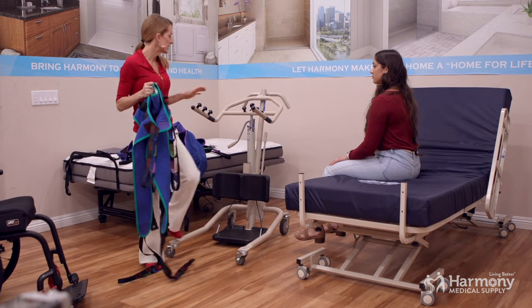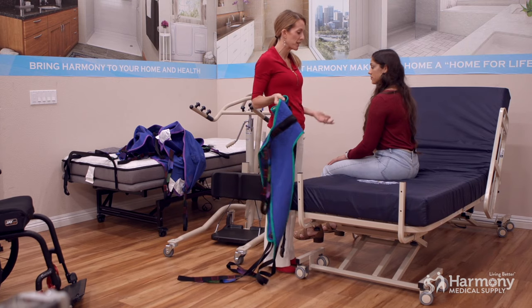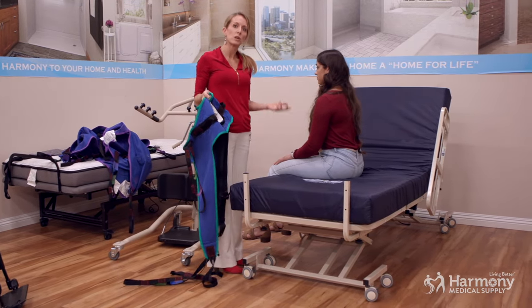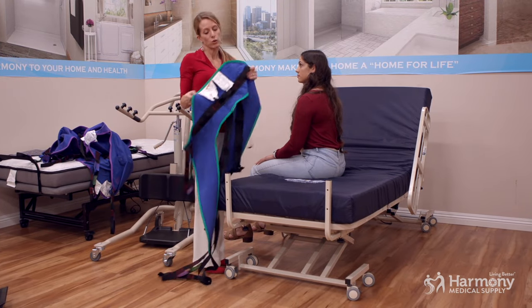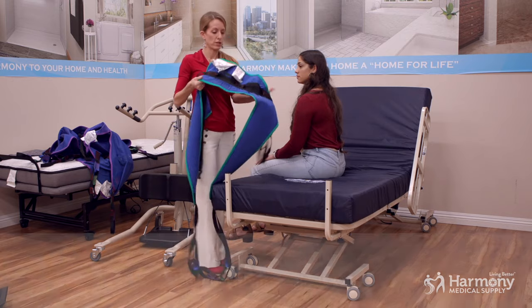With the sit to stand, the loved one or patient needs to be able to sit up on the side of the bed. This lift is for someone who is still somewhat able-bodied and can participate in their transfer, but their lower extremities aren't holding up for doing a stand pivot or their own independent transfer.